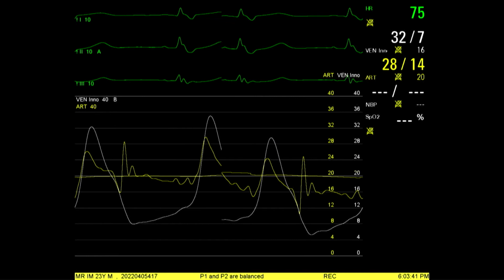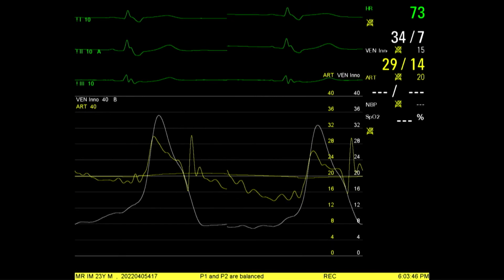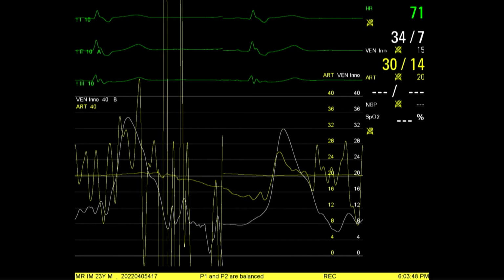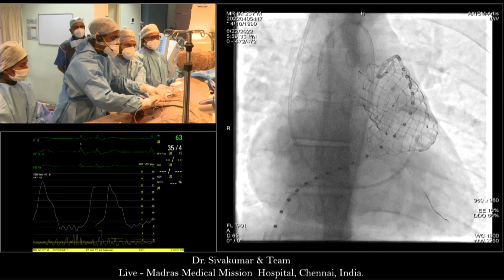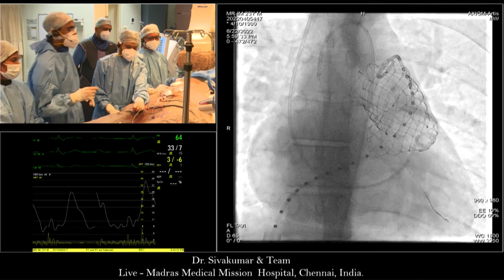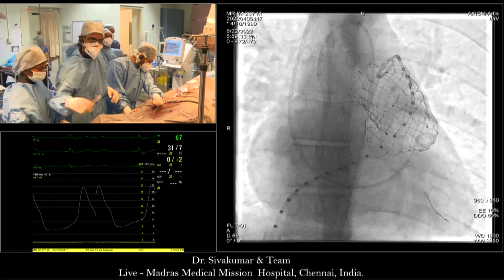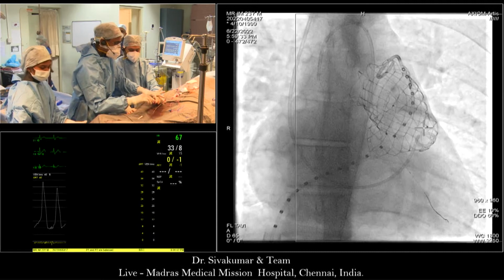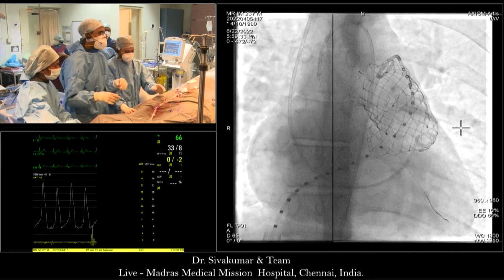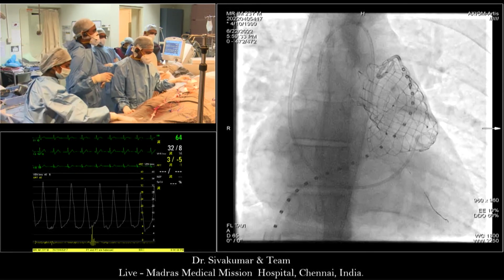Yes, we can see that, and there is a diastolic gradient. So now I will make an angiogram here in the pulmonary artery, to start with in lateral view, so please, Dr. Shak Qureshi, lateral view first. Shak, are you happy? Yes, thank you, as long as the pigtail releases the distal flare. I think it is not trapped.